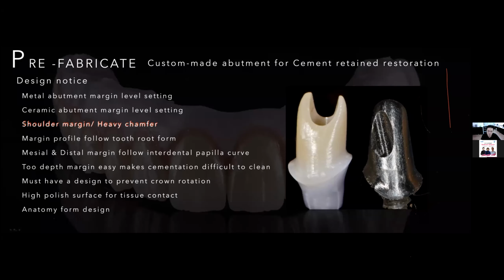For the zirconia restoration, please try not to design a feather edge, because a feather edge is more dangerous. Sometimes when dentists want to set the crown or the restoration in the patient's mouth, it is not at a very right angle. Sometimes your zirconia will chip, the margin will chip.